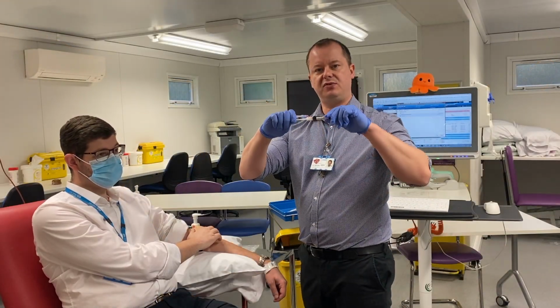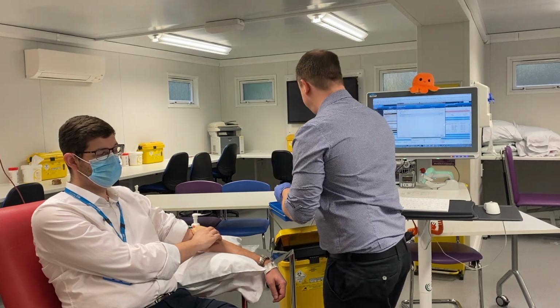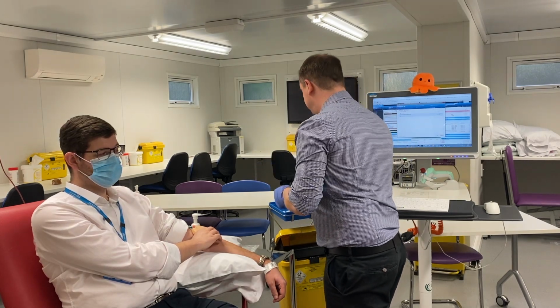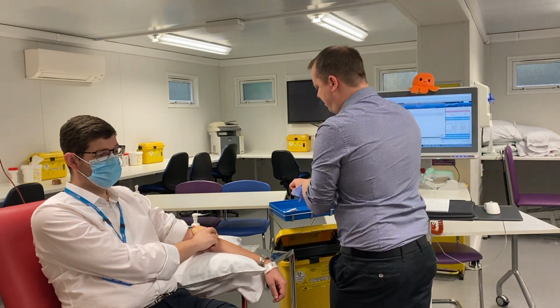My first bottle, because I didn't click it while I was connected to the needle, I'm going to click it now and then snap the tail off. And now my bottles are ready. So by my bedside, I'm going to take my gloves off.